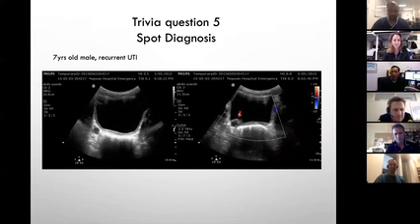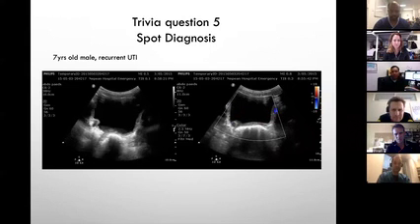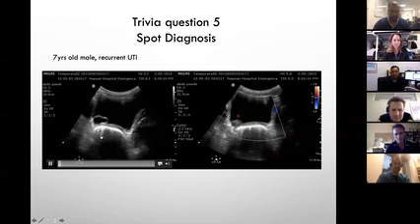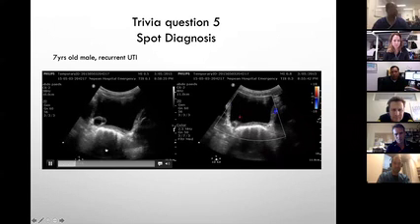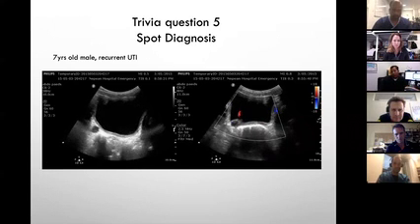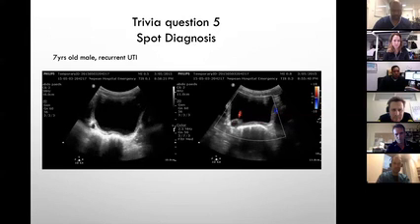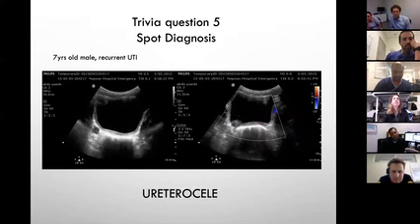Is it vesicoureteric reflux? Closer. Something actually protruding; reflux doesn't. The patient might have a ureteric reflux. Thank you very much. But what is that structure as such? It's got an anatomical pathology too, isn't it? 7-year-old male. Younger kid, yeah. Obviously, you guys don't see that often, but it's ureterocele.